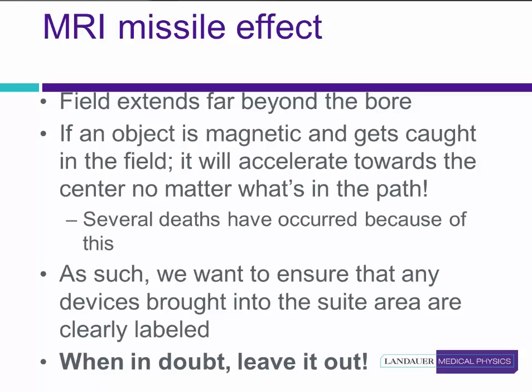While further education and oversight have decreased the risk, the ever-increasing utilization of MRI has made it necessary to ensure the education of everyone who works in and around the MRI systems. As we continue to increase the utilization of MRI, we have to ensure that any persons or devices around the MRI can stay safe. An old phrase which bears repeating: when in doubt, leave it out. If you're unsure about the safety of something, assume that it's unsafe.